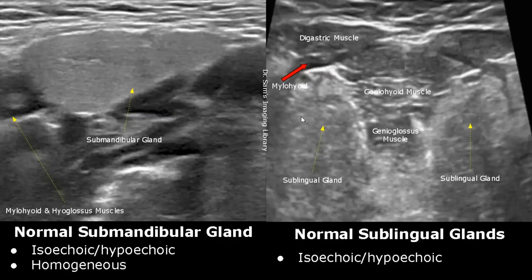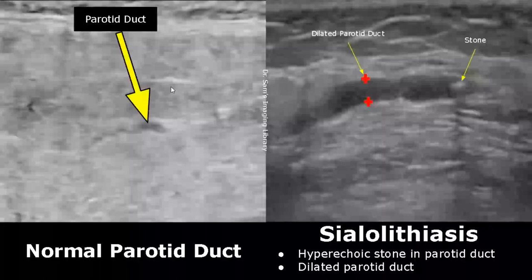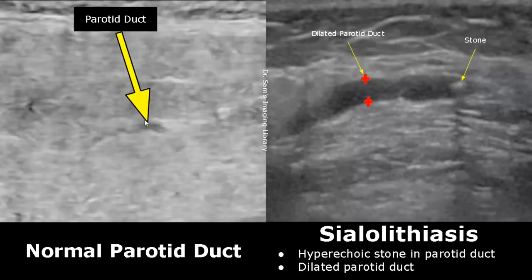Most of the pathologies involve the parotid and submandibular glands. In this image, we can see a normal parotid duct. It has a small diameter.